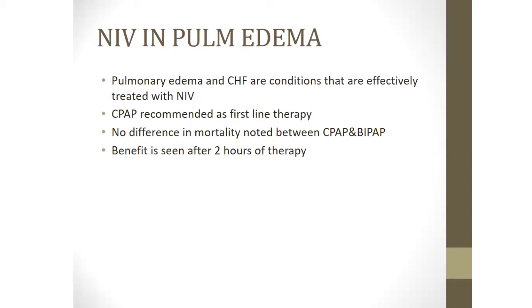You should give a trial if the patient is hypoxemic, in acute pulmonary edema, and conscious, without too much inotropic support. In those patients, you can try a CPAP to avoid intubation. Next slide, please.